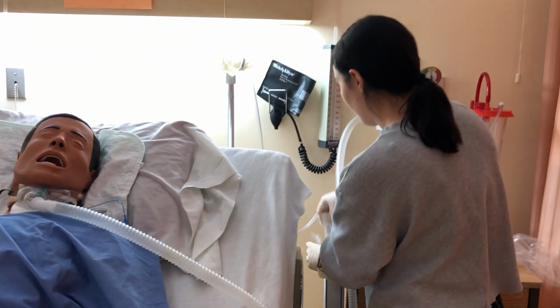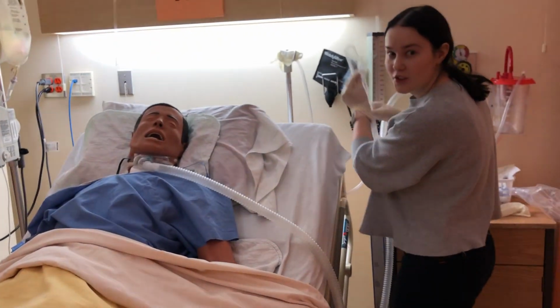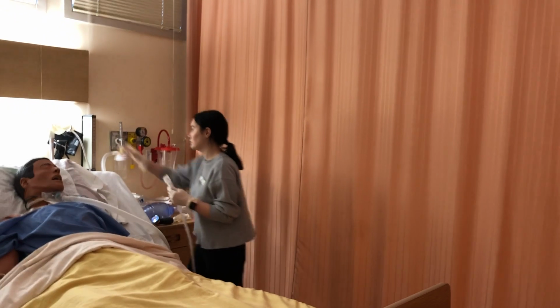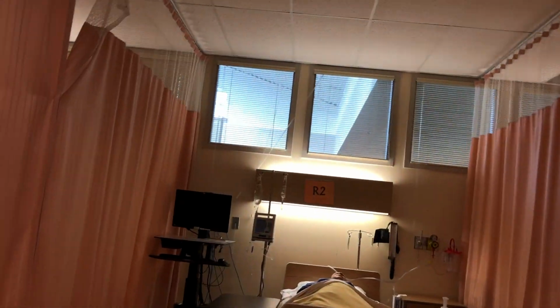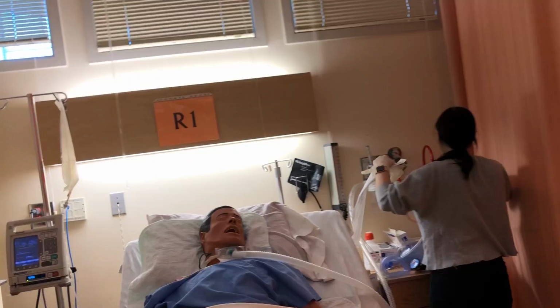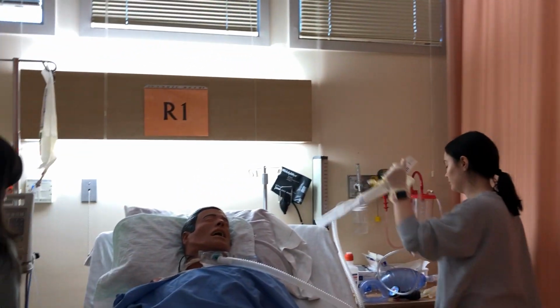Okay. Yeah, I just want to go get them. It keeps saying downward occlusion every now and then, so should we just put it on standby for now?